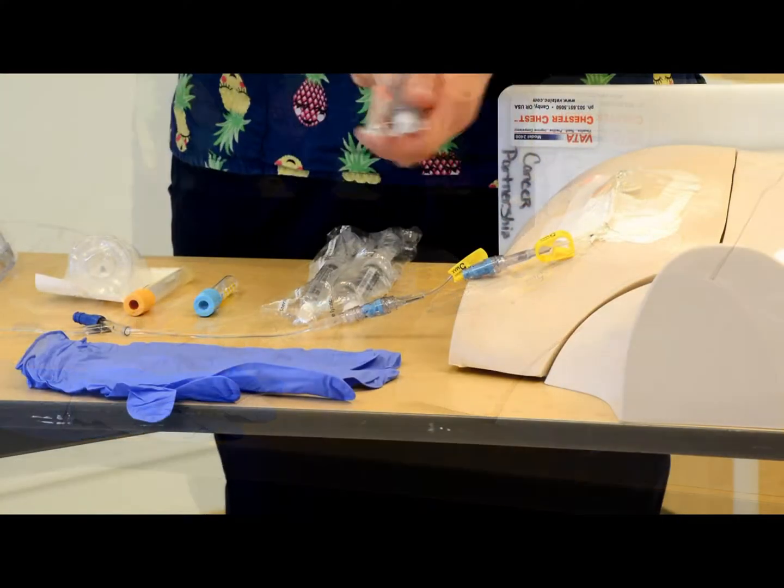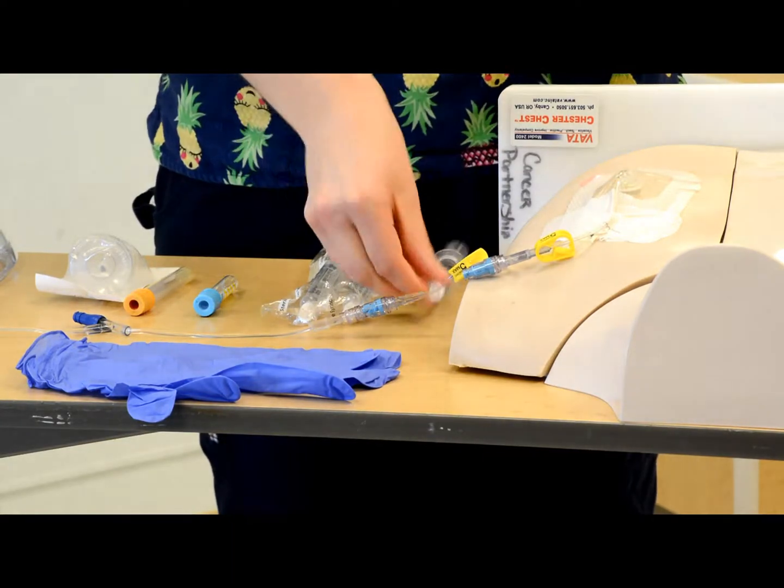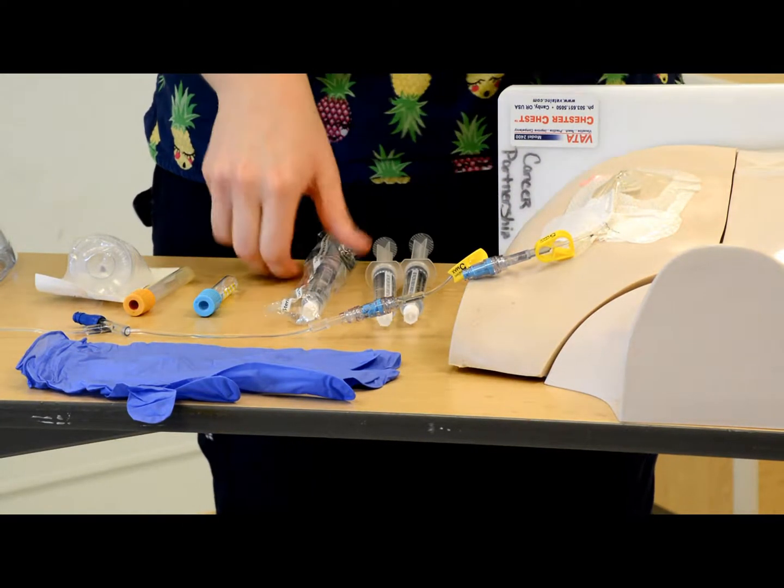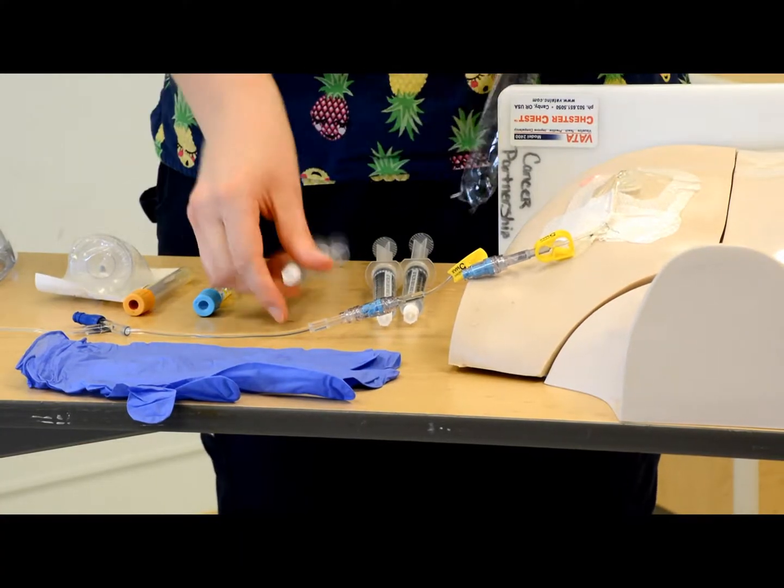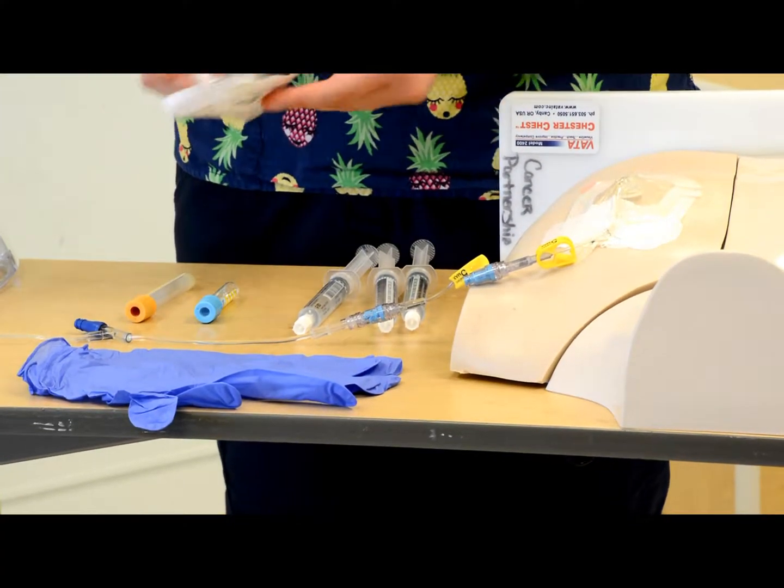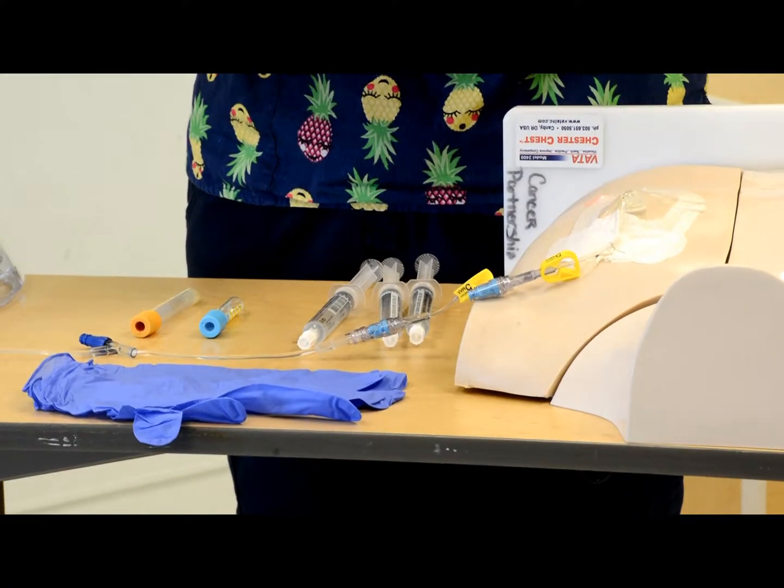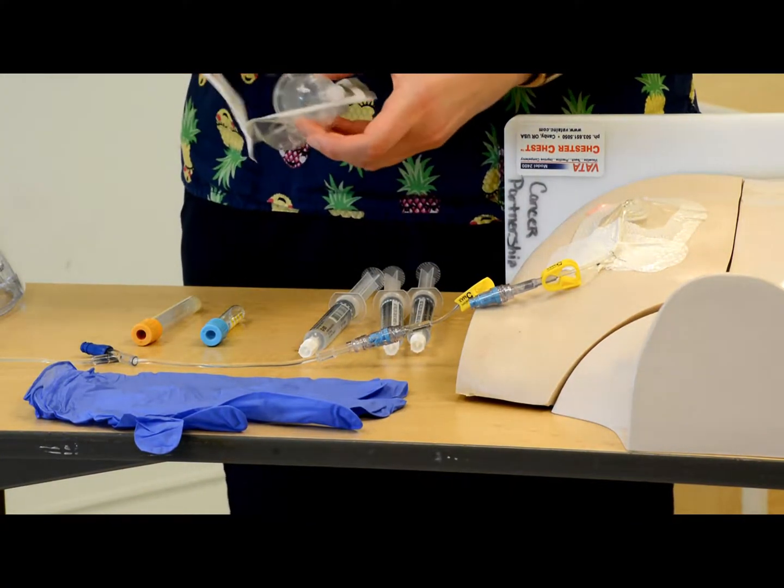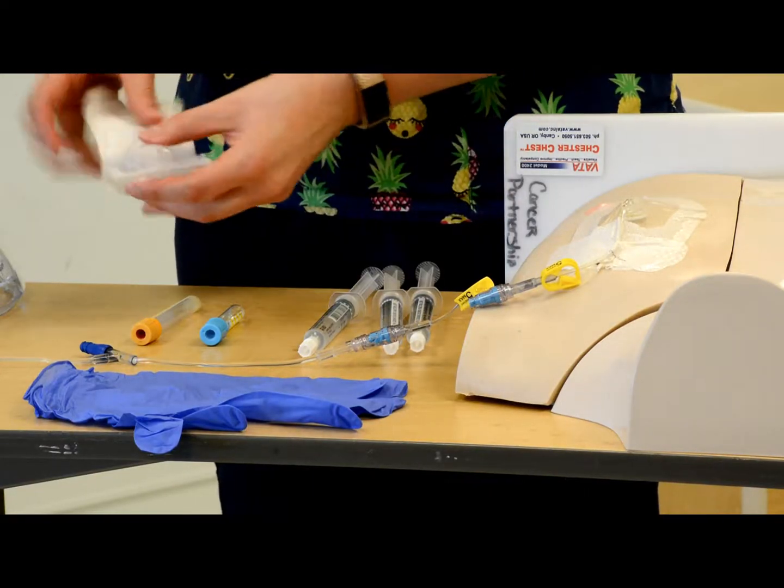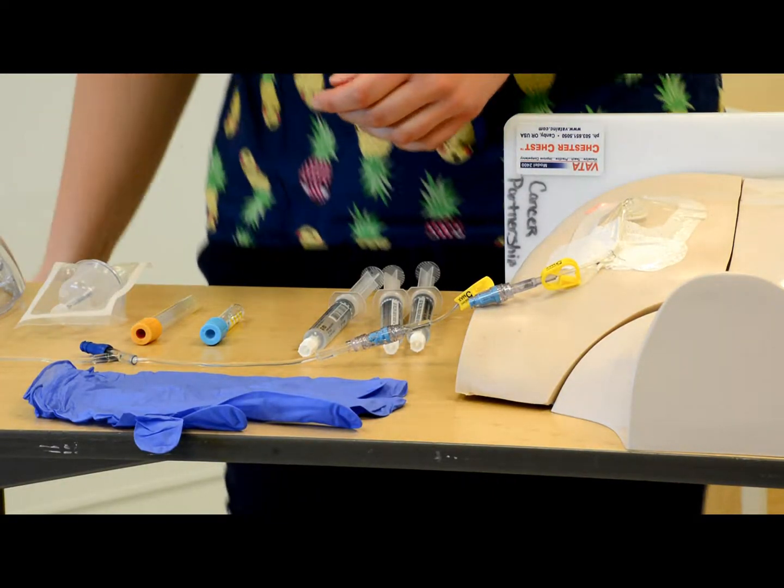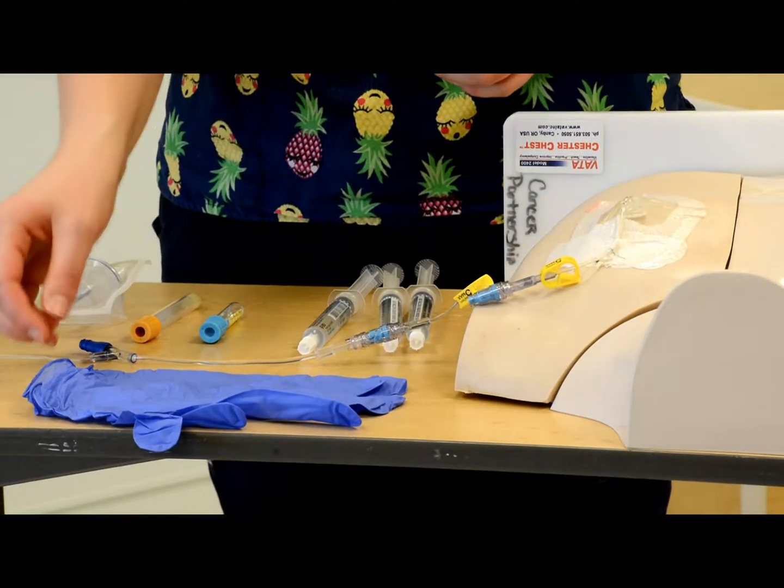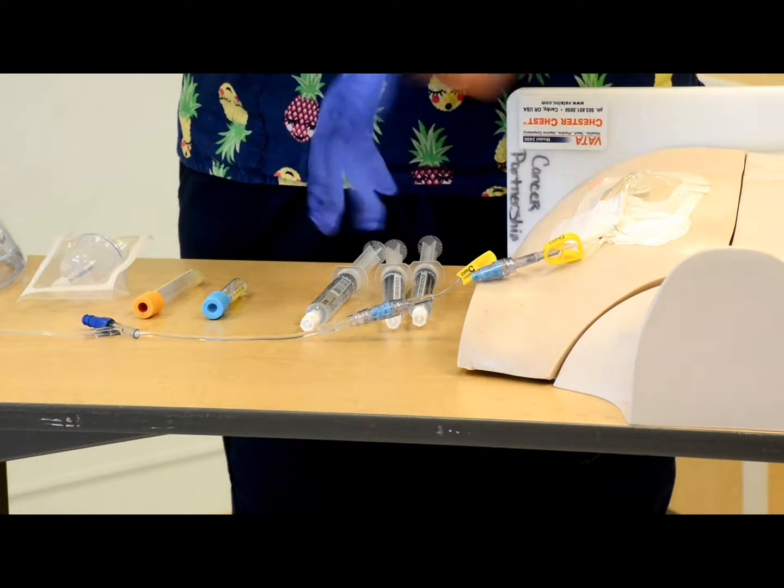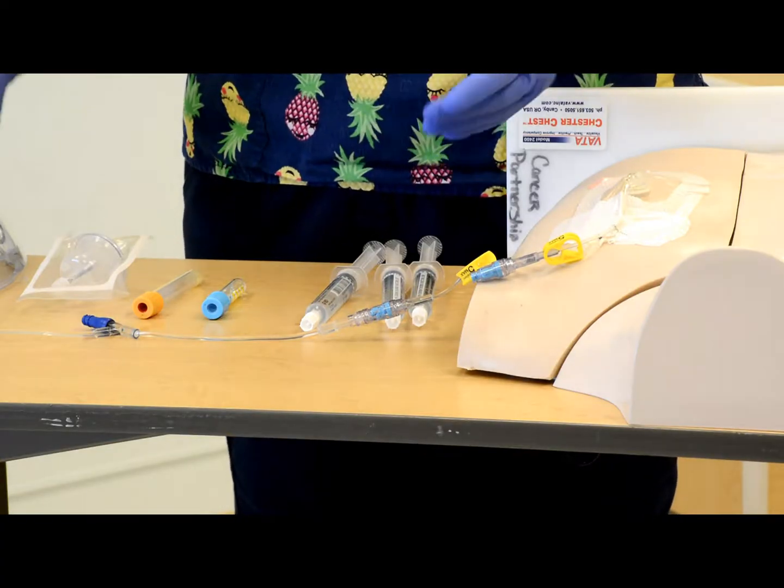So first I'm going to start by preparing my supplies, and make sure with your transfer device that you are keeping the tip sterile. This particular one has a cap on it, sometimes I like to just nestle that in the packaging. Now I'll put my gloves on, and put on my optional eyewear.